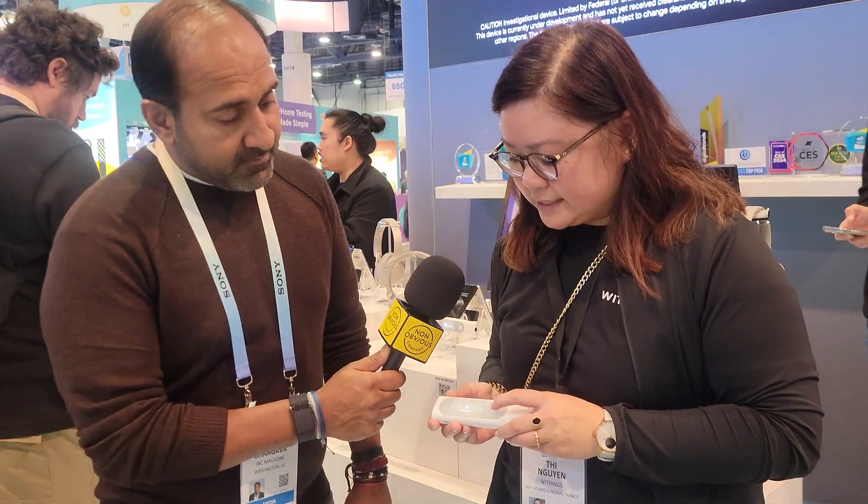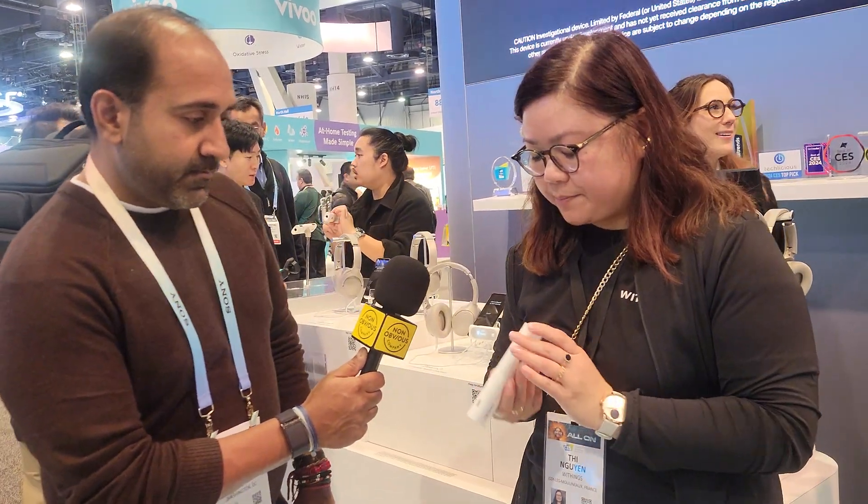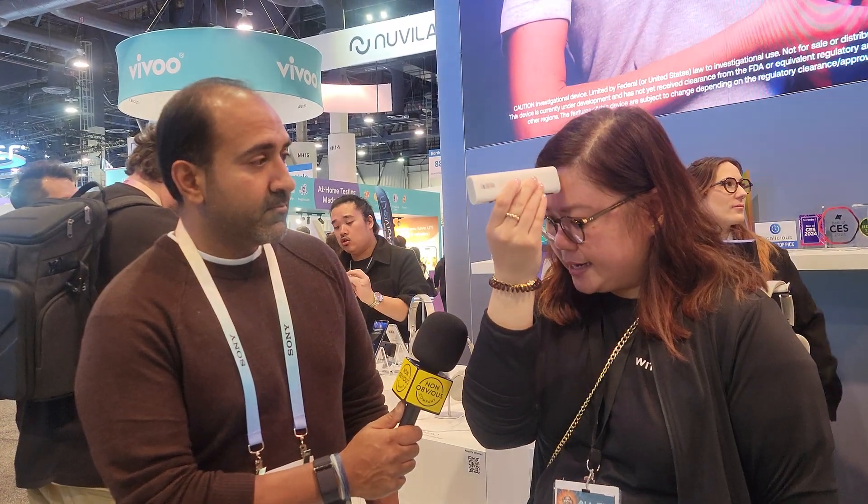The first measurement is through the temperature sensor. You'll be able to assess your body temperature by scanning your forehead like so. The result will be displayed both on the device and also sent to your app.